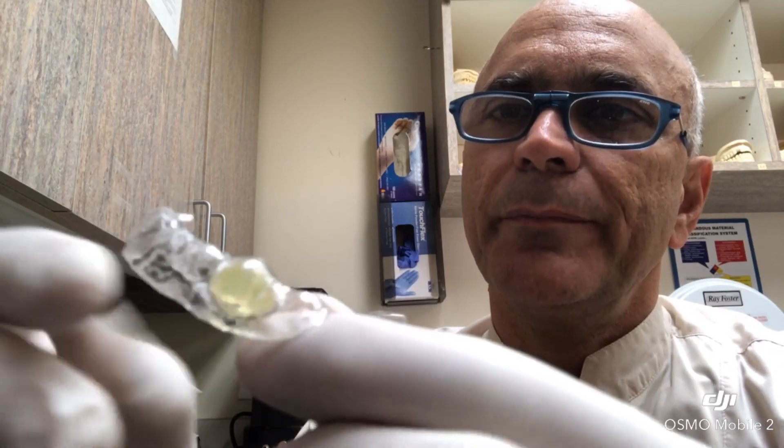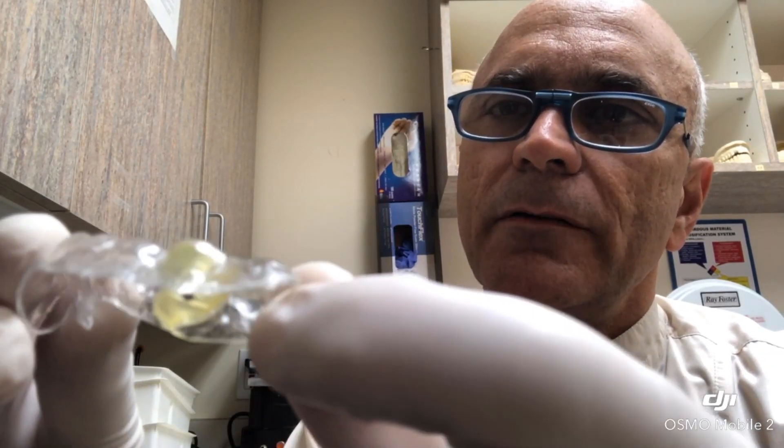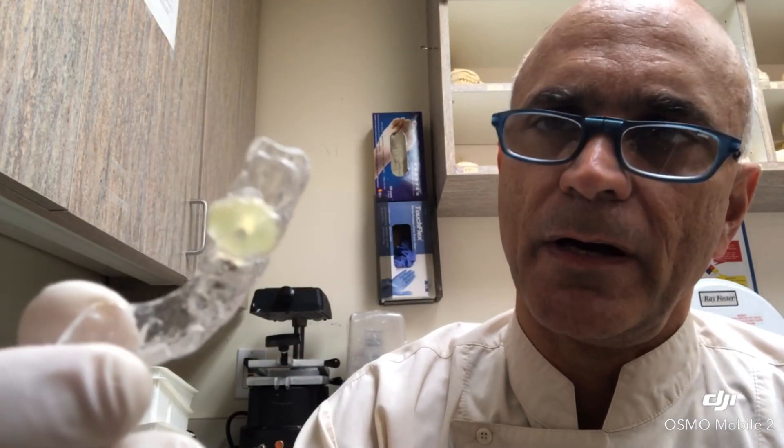This is the surgical guide that we prepared based on the patient's model. It's got a piece of gutta percha in it, and the scan was taken with this in the mouth. And it shows that the marker is exactly where we want it to be.